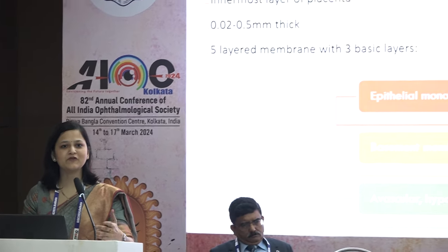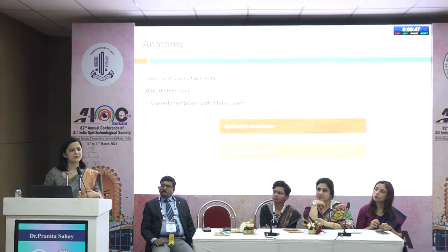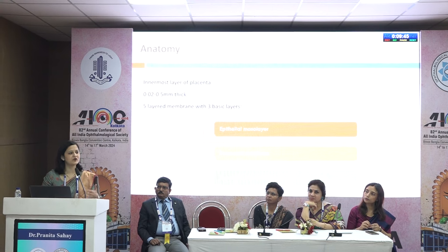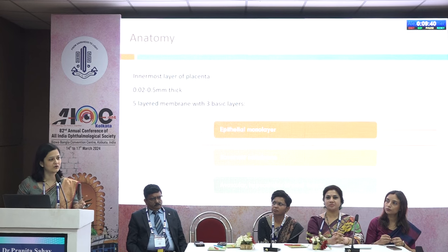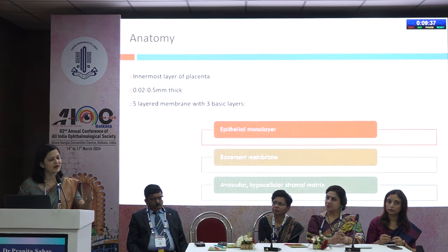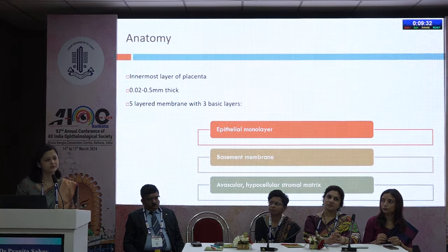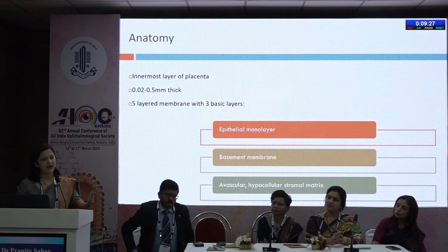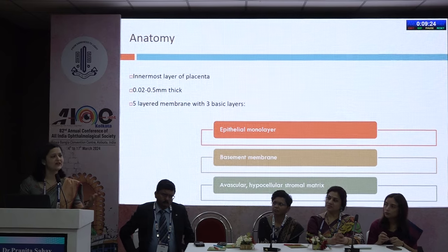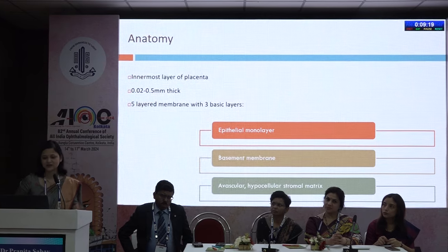I'll be talking about amniotic membrane grafting. When the name of amniotic membrane graft comes, everybody thinks that this is something pertaining only to cornea specialists. But here I'm to tell you that amniotic membrane grafting is a very simple procedure. If you know the basics, when, where, and how to do it, it is something that should be done by everybody. It is not a difficult task that you need to refer a patient to a cornea specialist for. If you know about the dealers who provide AMG in your city or state, and you know how to deal with this technique, it can be done even by a general ophthalmologist or an ophthalmologist practicing another specialty.